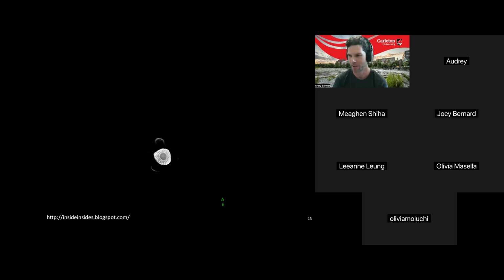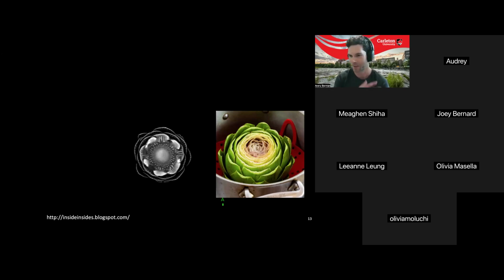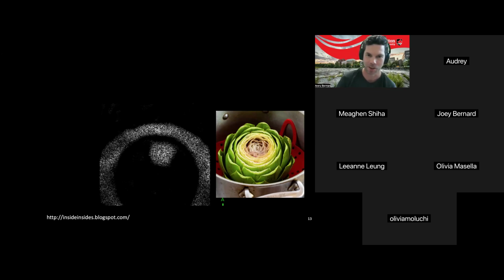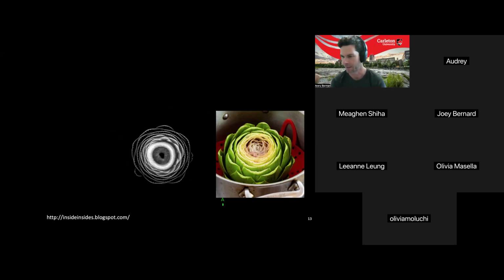Little trickier, quite beautiful, very geometric. Oh yeah. All right, we're converging. I see some right answers there. This is indeed an artichoke. And again, just going slice by slice through it. But we don't actually have to slice it up. The MRI does that itself. It can encode in 3 dimensions. We don't need to take a scalpel or a knife or a butcher's block at all to this. I think this is the last one.